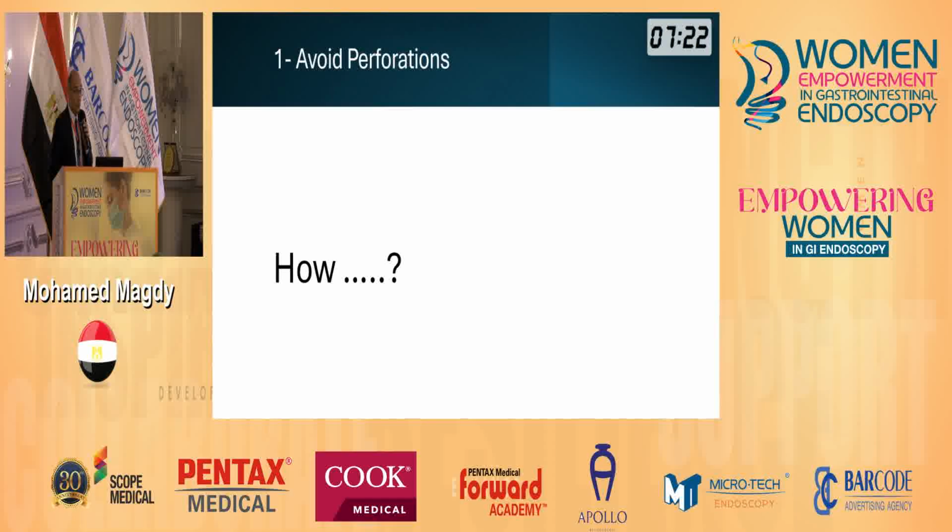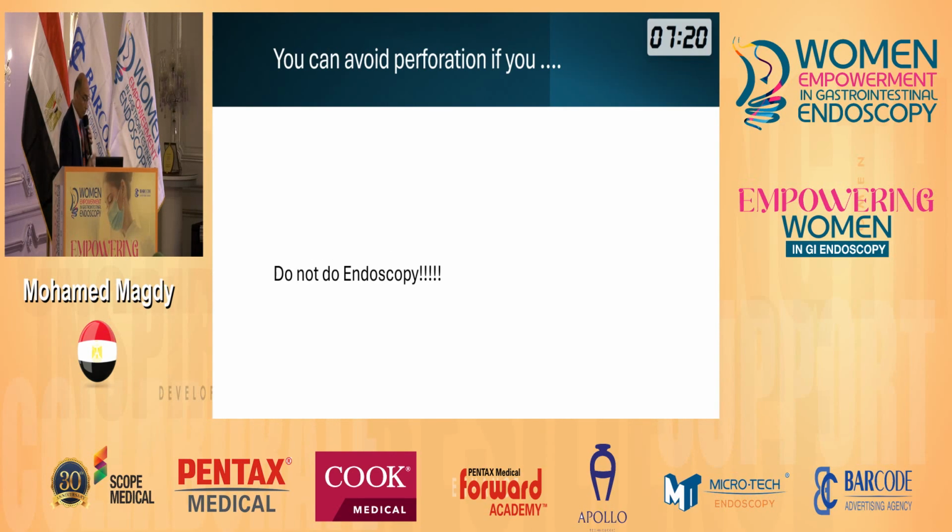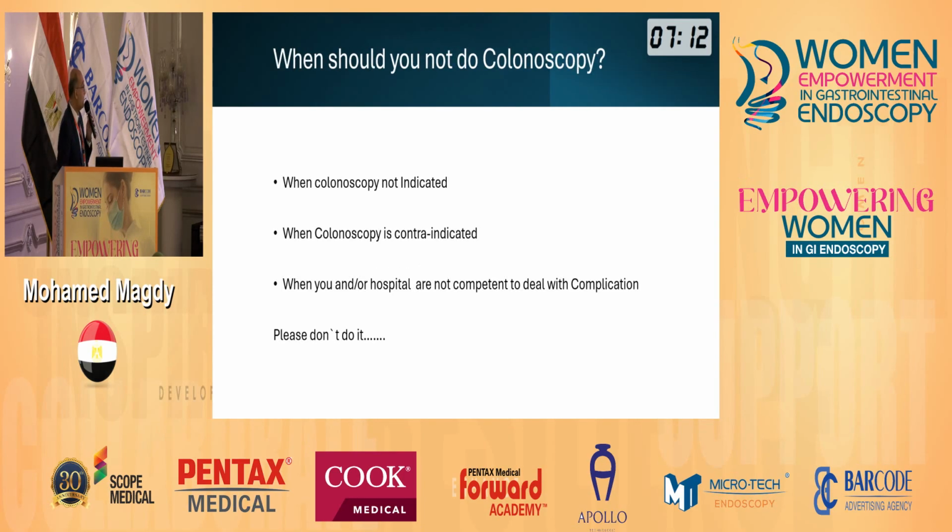How to avoid perforation? To avoid perforation, don't do endoscopy when colonoscopy is not indicated. Colonoscopy is contraindicated in patients with intestinal obstruction and patients with comorbidity.